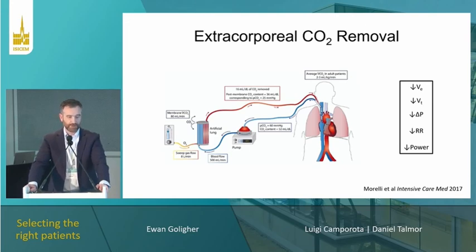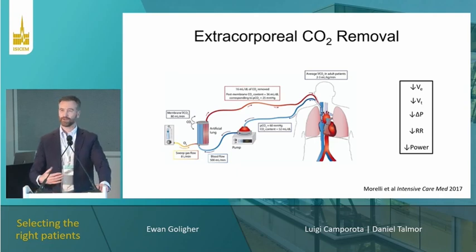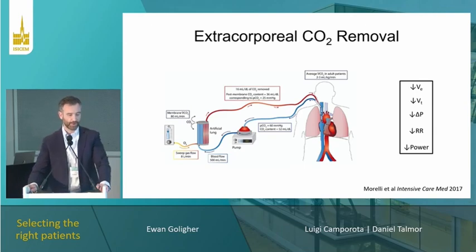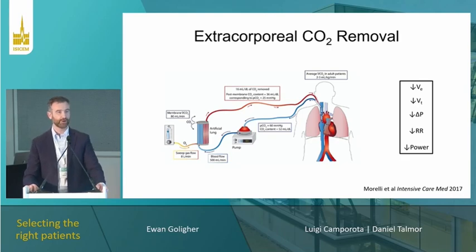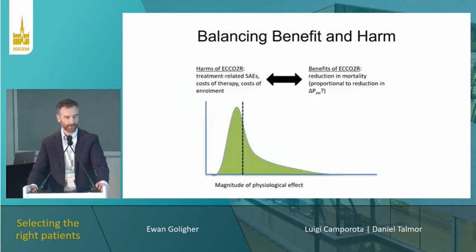The concept is relatively simple. The idea is that you cannulate a vein, and because you're using relatively low flows, you don't need that large of a cannula. So this kind of extracorporeal intervention would be more like dialysis and less like ECMO. That's the hope and the goal, with a goal of reducing complications, making it easier to apply in centers that don't have existing ECMO experience and expertise. And of course, the goal of the intervention is really, like Professor Hilty said, to reduce the stress and strain applied to the lung, the minute volume, the tidal volume, the driving pressure, and the mechanical power.